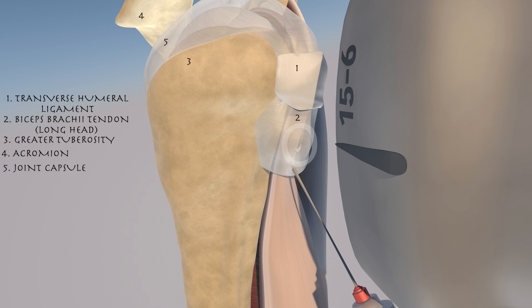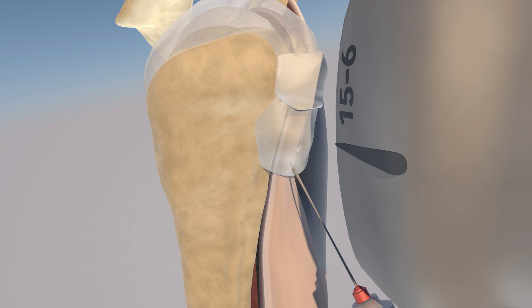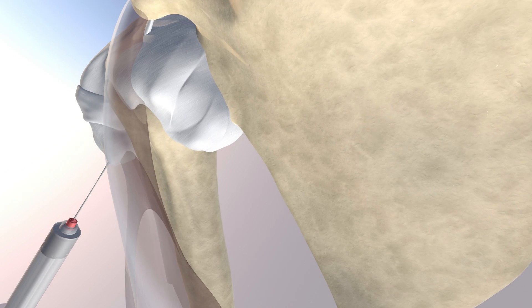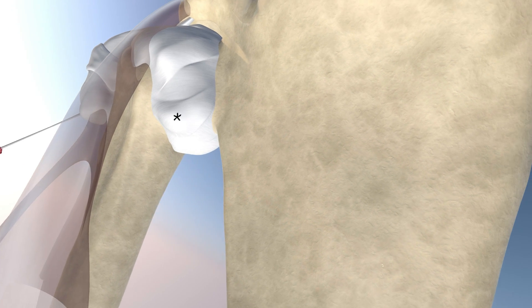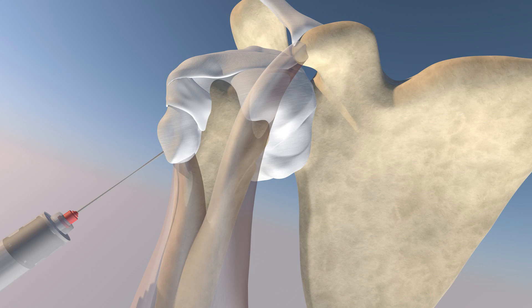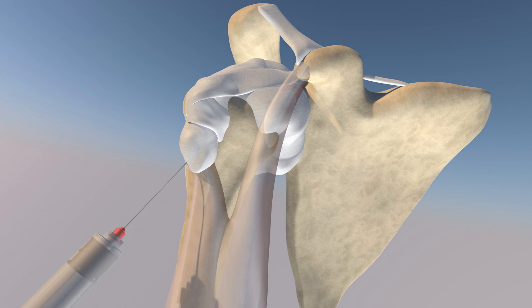You can appreciate the injectate contouring the surface of the biceps tendon, and you can appreciate how the injection can travel approximately into the actual shoulder joint itself. Now we're looking at the glenohumeral ligaments. You can appreciate the anterior band of the inferior glenohumeral ligament, as well as the middle glenohumeral ligament. The biceps muscle is made translucent. Here you can see the needle going into the bicipital tendon sheath, which is continuous with the joint.